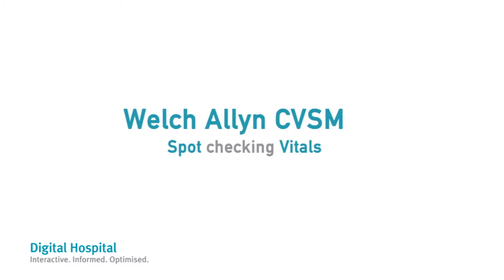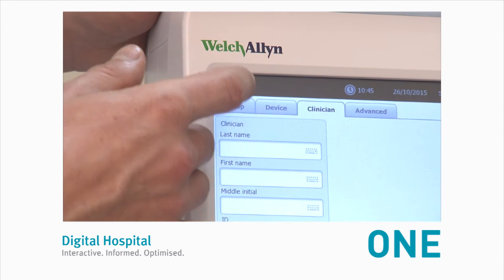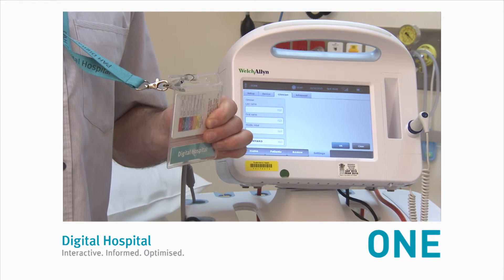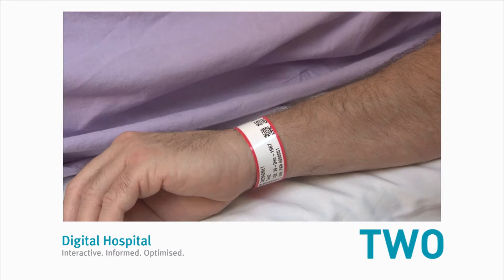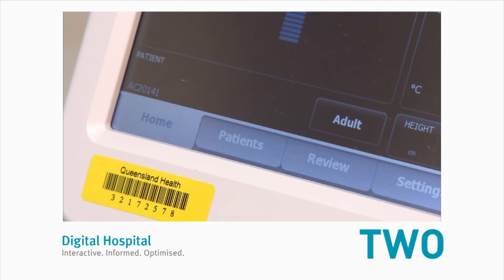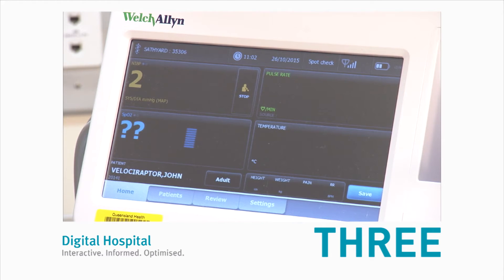First, spot-checking vitals. Number one, touch the clinician ID icon at the top left-hand corner of your home tab and scan your clinician ID, then press OK. Now connect your patient as per normal with the BP cuff and O2 SATS probe. Number two, scan your patient's ID wristband and wait for the patient's name to appear in the lower left-hand corner. Number three, take the vital signs by pressing start.